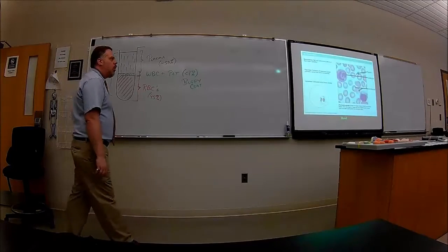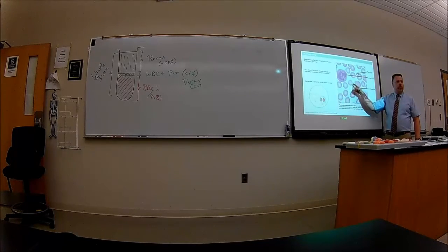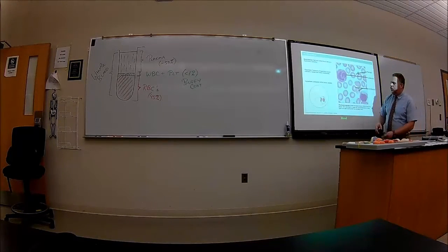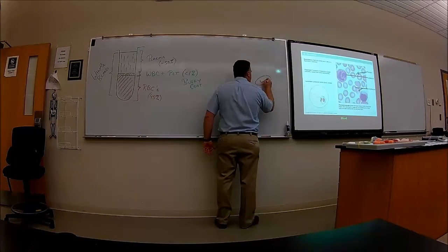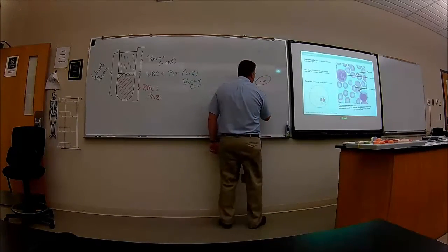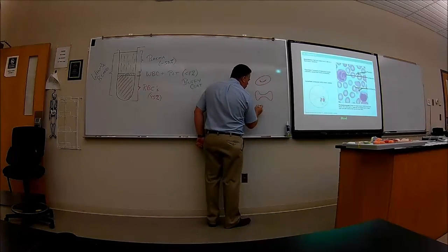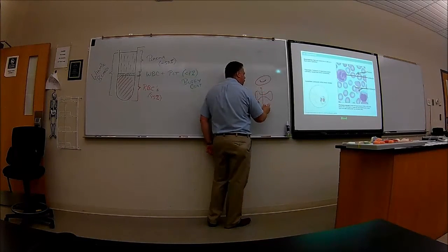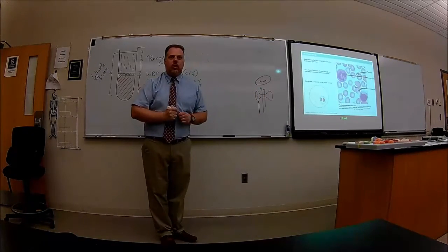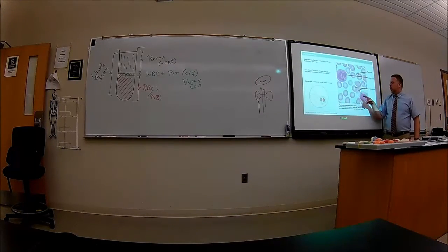Okay? So this is what it looks like. Red blood cells are like this. We have a lot of those, as you can see, and the red blood cell is like this, but there's no hole in it. When you look at a side view of a red blood cell, it's kind of shaped like that. It's just that when light goes through, it can't go through the thick part, but when it goes through here, it can pass right through. So it looks like there's a hole in the center, but there isn't. It's just thin there. You have white blood cells. We're going to talk about the differences. They look like this. And we also have platelets.